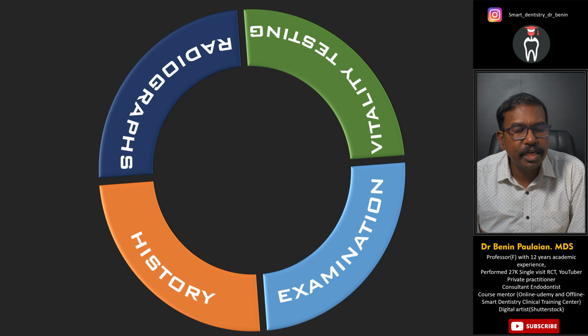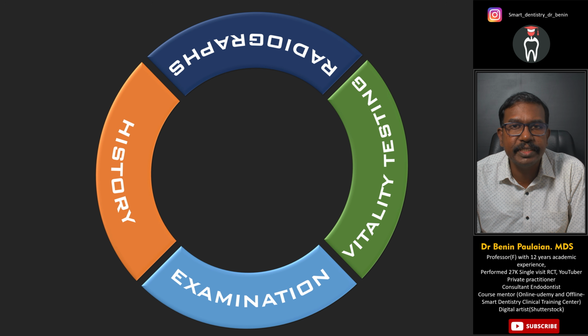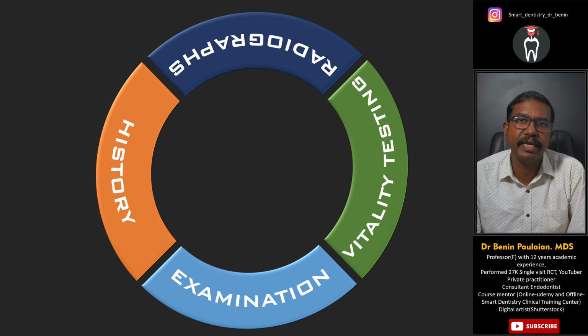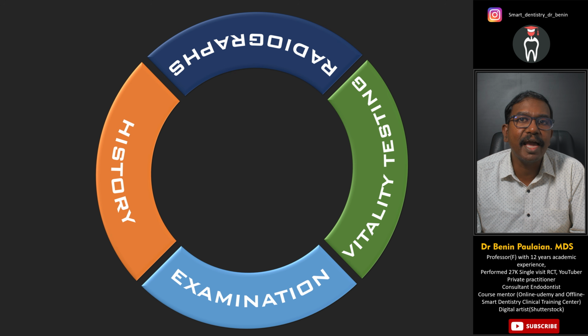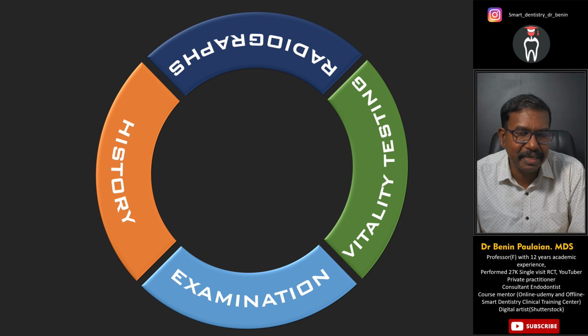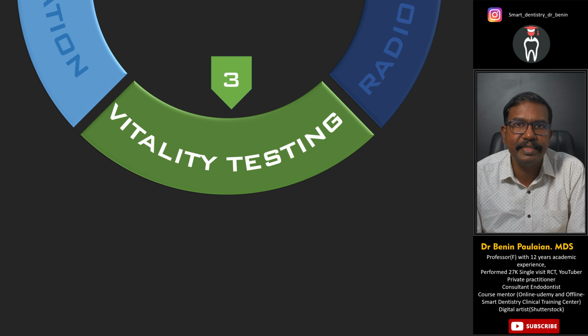The history, listening to the history of the patient, doing a good clinical examination, then doing a vitality testing, and then proceeding with a radiographic examination. In the first part of this presentation, I have explained about the history and the clinical examination. If you haven't seen that part, I would ask you to watch that part before proceeding with this presentation so that it will be easy for you to understand. Today we shall continue with the vitality testing.